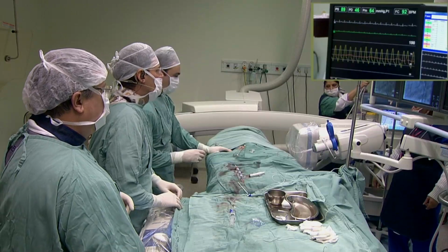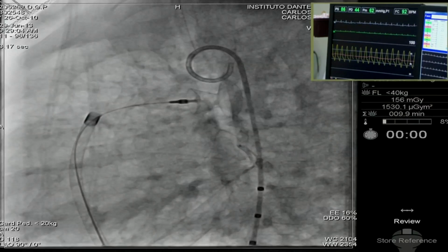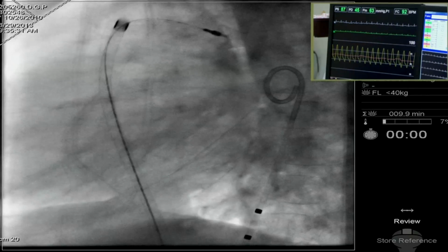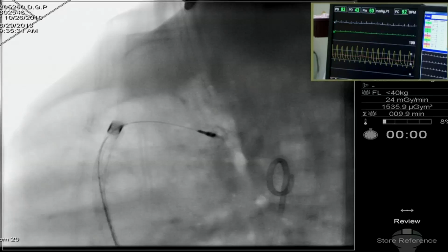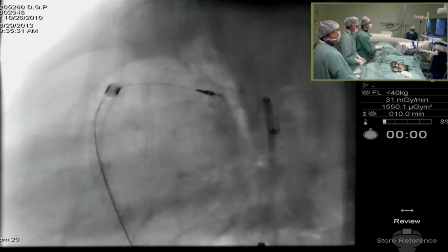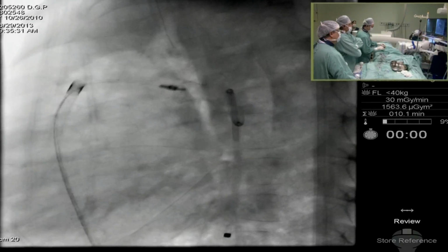Try to get it like the pictures of the device, only pushing with the pigtail to the right position. This was my first recommendation. I think that the choice of the device is very, very good. Is there some possibility to try to put it together?